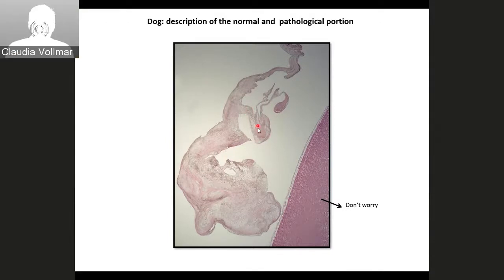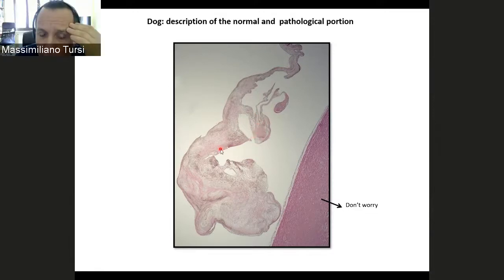Also here. And that's because there is the rupture of the chordae tendineae. In the previous case, we looked with Joao at the rupture of the chordae tendineae, for example. And that's because also the chordae tendineae, in the very chronic stage of the disease, have the myxomatose degeneration. But it starts here, and then with time grows in this direction.